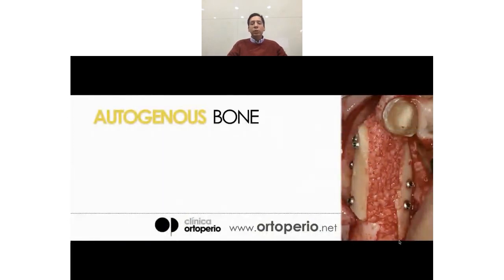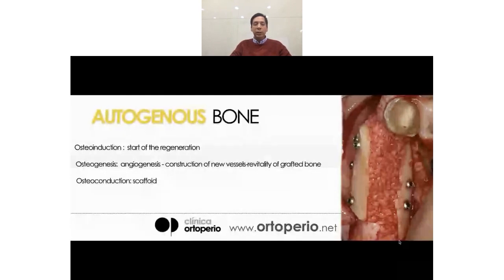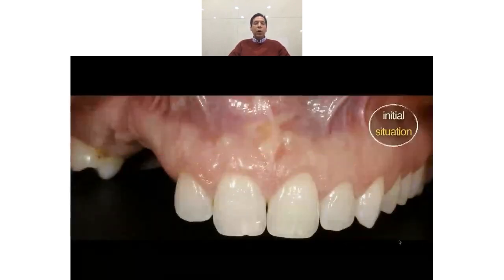I use only autogenous bone because we all know that autogenous bone is the gold standard, and it has the three properties that we look for in any grafting material. I mean, osteoinduction, osteogenesis, and osteoconduction. So I will start by presenting cases, and in those cases, you will see my tips, my approach, the way I treat my patients. And I think you can obtain some ideas, or I will try to share with you the rationale why I do what I do.